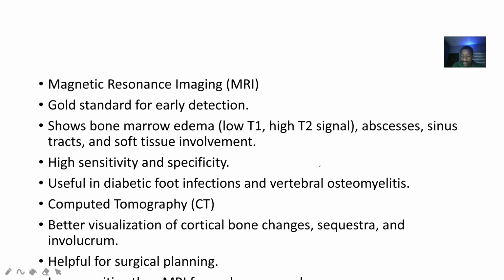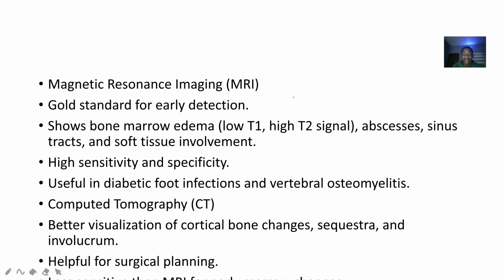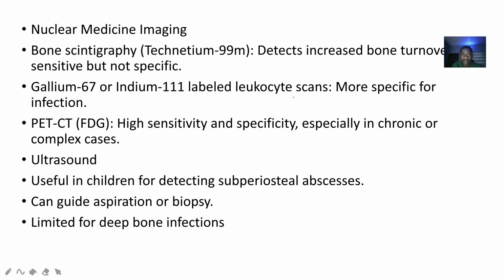We also have CT scans, computed tomography. A CT scan will give you a better visualization of cortical bone changes, also sequestrum and involucrum. Right? It's helpful for surgical planning.